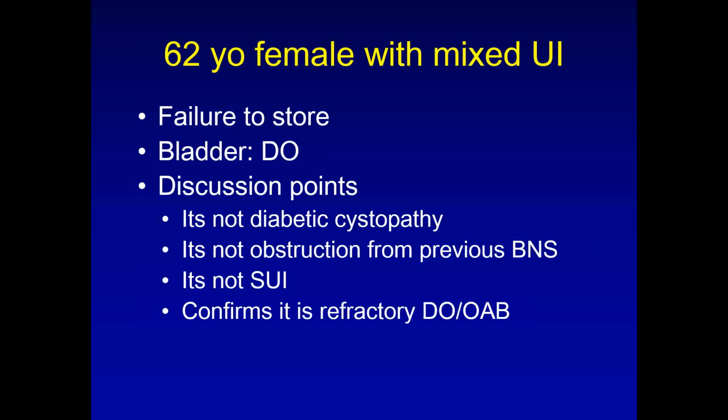This is a case where you don't think the previous suspension or bladder suspension is causing a problem. So you can continue going after the OAB. Again, if you want to pursue more meds, you should do so. If you want to try Botox or an InterStim pathway, I would think you would do well with this patient.